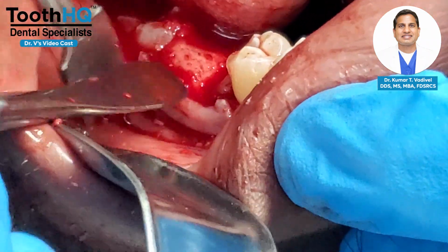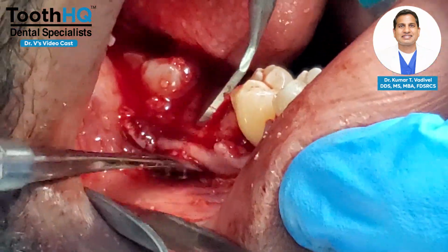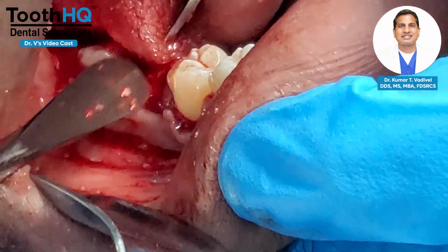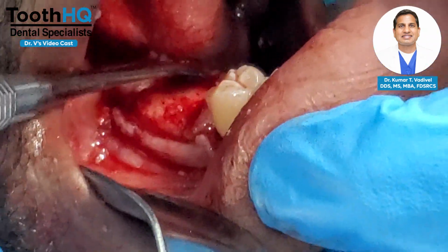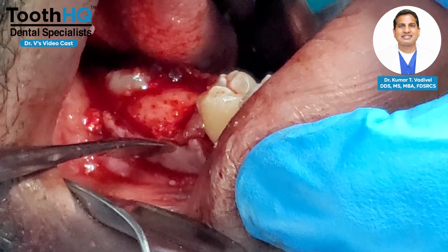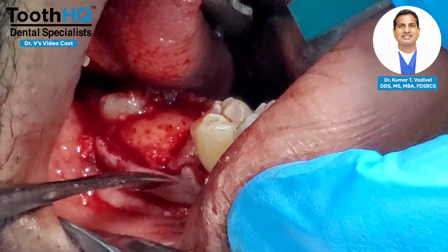Because if you are going to pick a membrane that's just going to tear as you are trying to get these procedures done, you're going to get really frustrated. So now you can see the membrane is all tucked under, on the buccal as well as on the lingual. Now the next step will be to try and close the area with some sutures, okay?